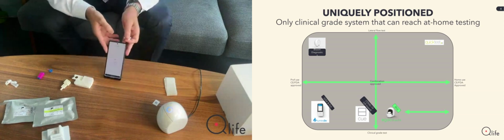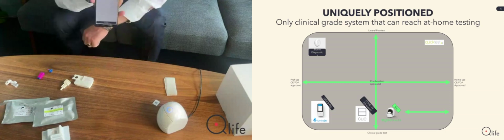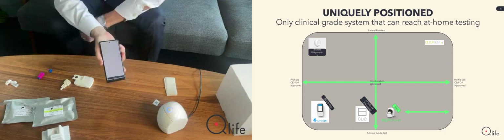You can see it here. I'll take it a little bit up. Yes, there it is. A little bit down again. That's better, maybe.